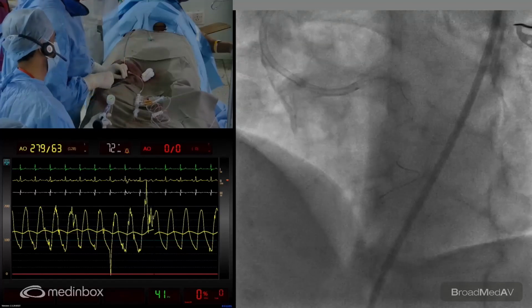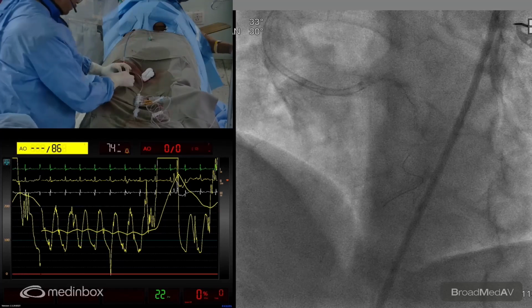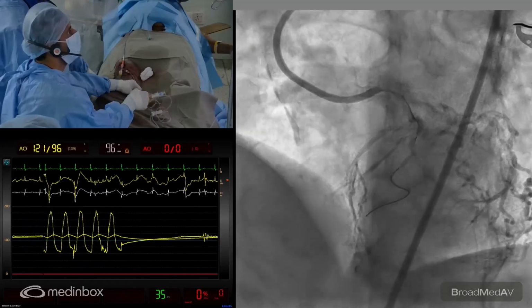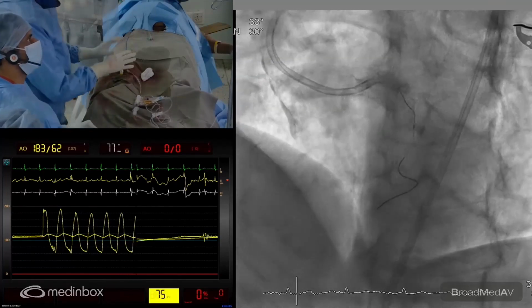So hopefully this has done the trick. And we try to get an IVUS now and see what we've done. So we went up to 24 with a 4.0. So I think we have got a reasonable result. The guiding is inside, but we'll take the IVUS and see it. The guiding is not really compromising anything. So we'll get down the IVUS and then pull the guiding out and check the whole stent. The issue is whether we need more. So 4.0 at 24 is how much, sister, please? What is the size at 4.0 24, please?